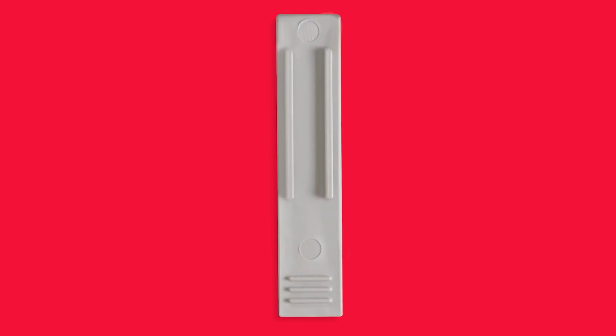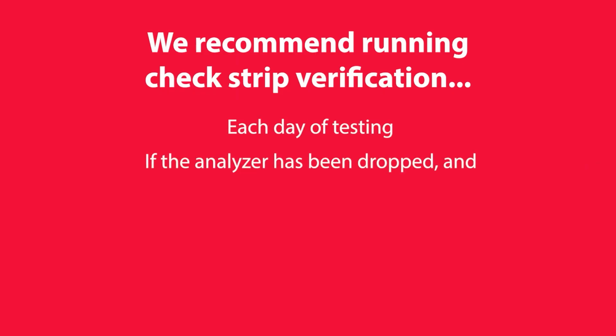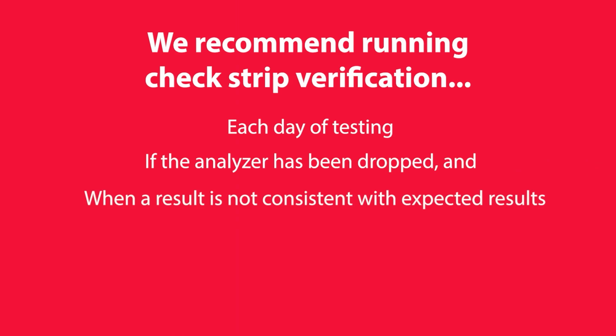Before running patient tests, verify that the analyzer's electronic and optical systems are working properly by running a check strip verification. You'll use the gray check strips included in your carrying case. We recommend that you run a check strip verification each day of testing, if the analyzer has been dropped, and when a result is not consistent with the expected results.